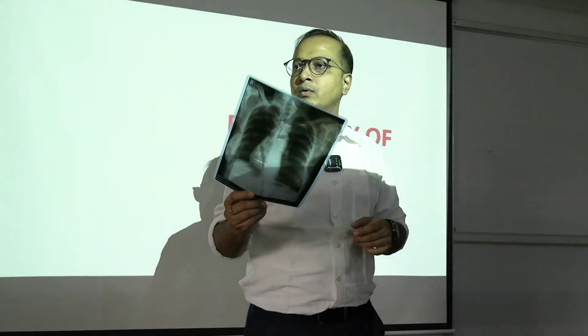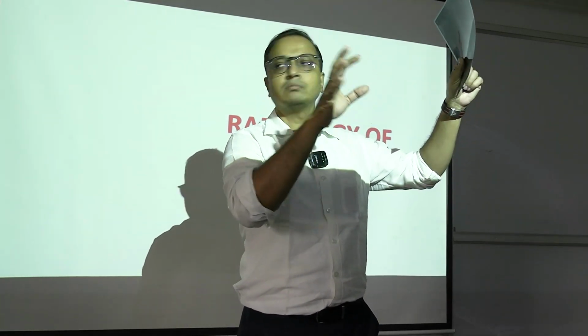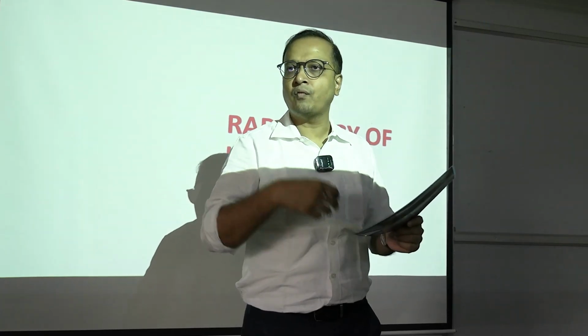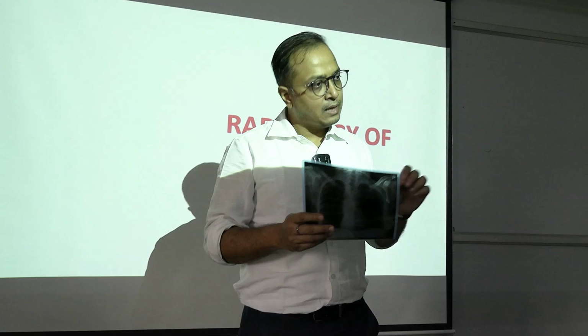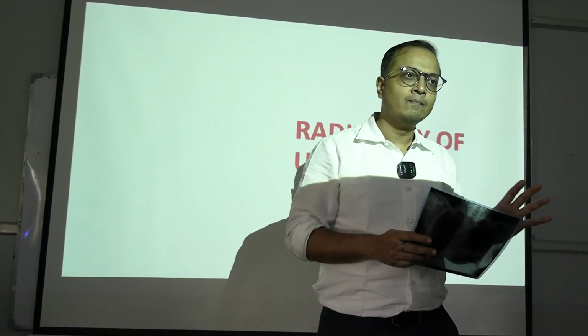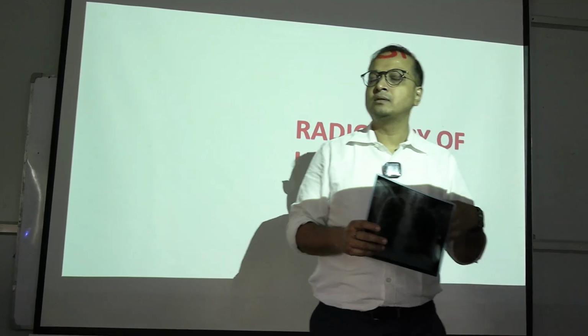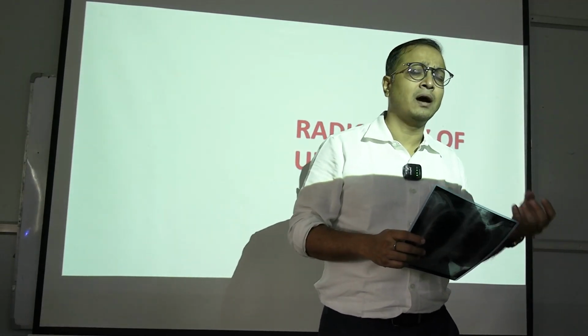So, what you are doing is reading or decoding the X-ray plate of Mr. or Miss so-and-so of this age. And even the referring doctor who is treating this patient and has referred them, that name is also written on it. So, we have all the details related to this patient, the initial patient identification.